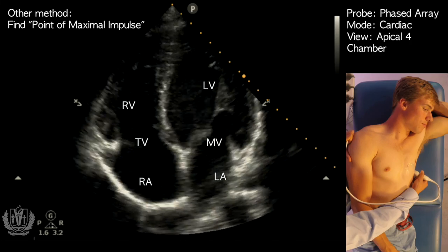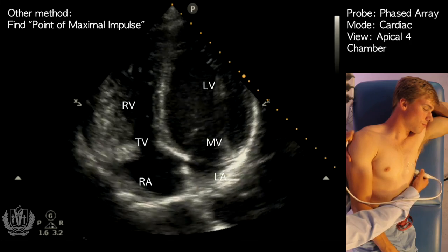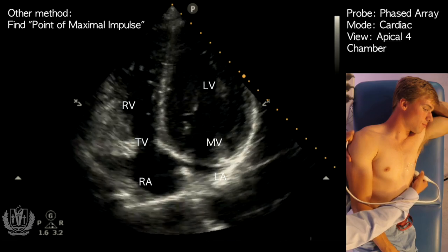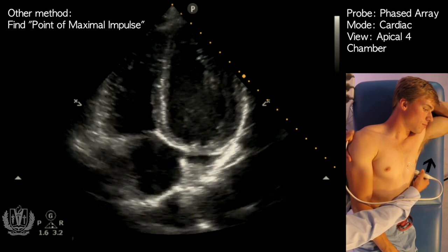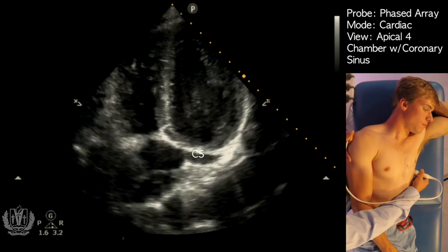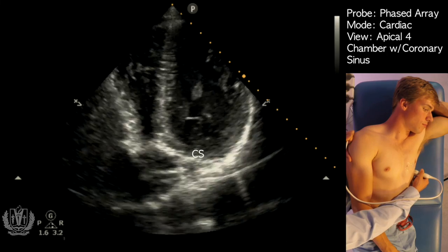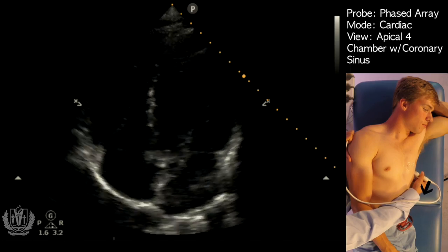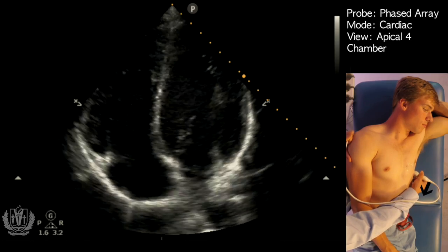Sometimes you'll get views that look a little different, and that really depends on the angle of your probe. If you tilt the probe down towards the patient's foot, you get what's called a coronary sinus view — you can see the coronary sinus coming into view. As you tilt it more towards the head, it gives you the apical four-chamber view.